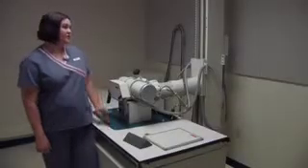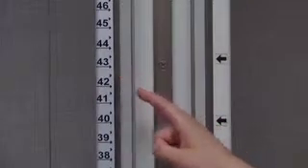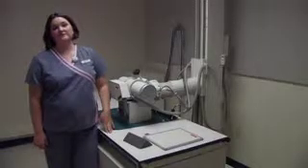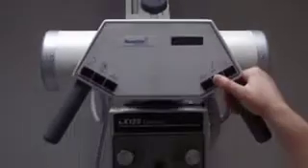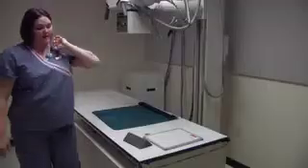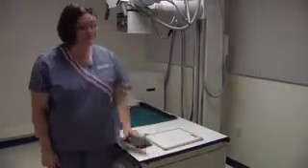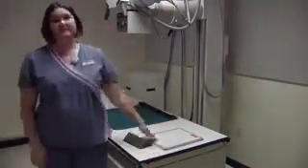To set the tube, you need to go to 43 inches on our measurement for our tube. That would be 40 inches to the tabletop. And since we're going to have the patient sitting at the end of the table with his knees away from the tube, we're going to have to move the tube down to the end of the table.